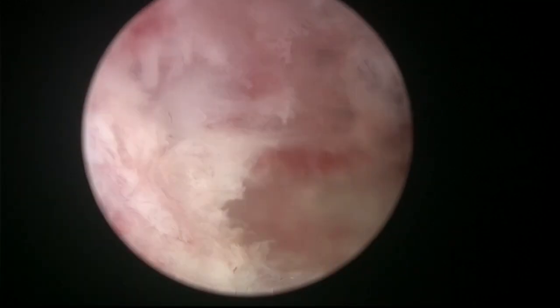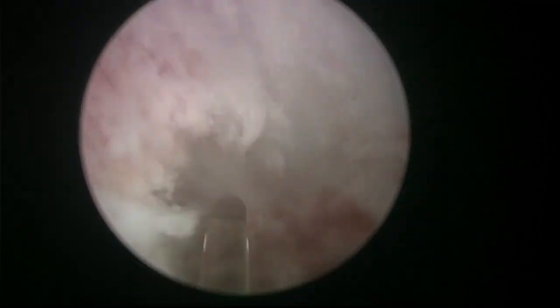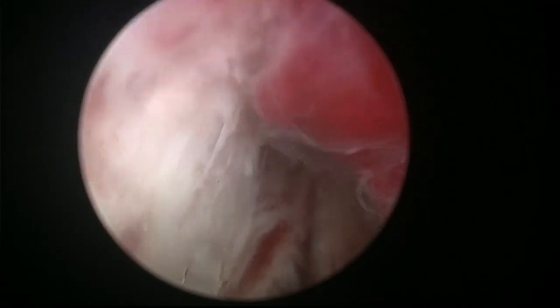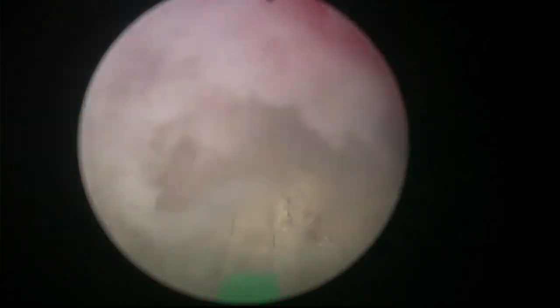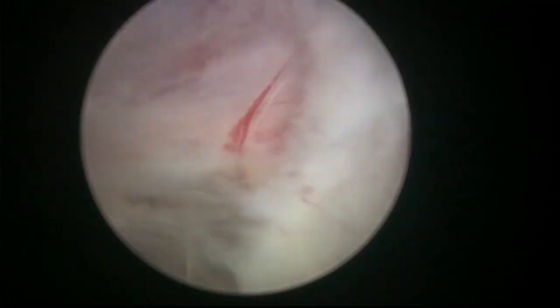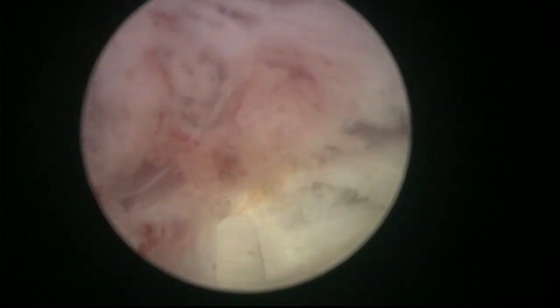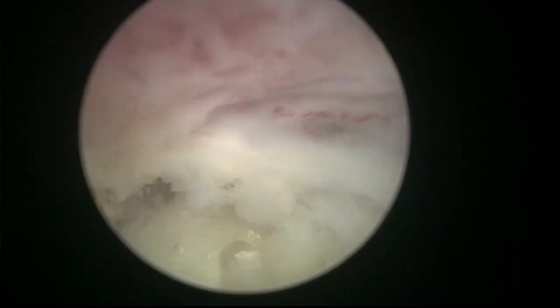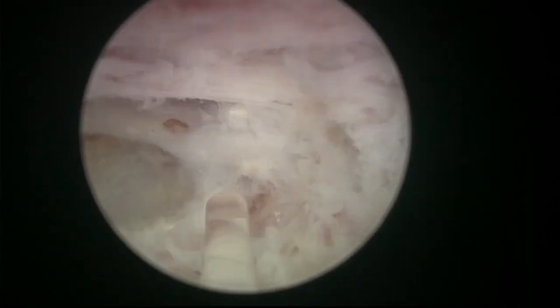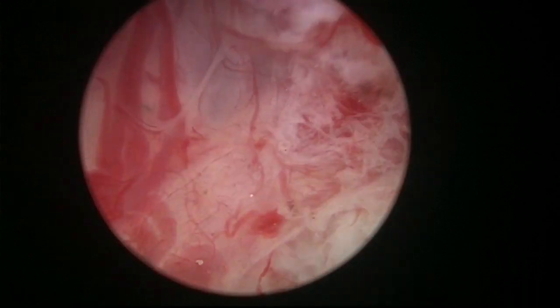So, next thing I'm going to do is to cut the attachments of the adenoma to the sphincter and try to make things easier for later on in the procedure. But initially, I like to focus on the lower aspect, so from 3 o'clock to 6 o'clock. So when we enter the plane, we don't stretch the sphincter in this region. The fact that we liberate this generates a little bit better access towards the side.